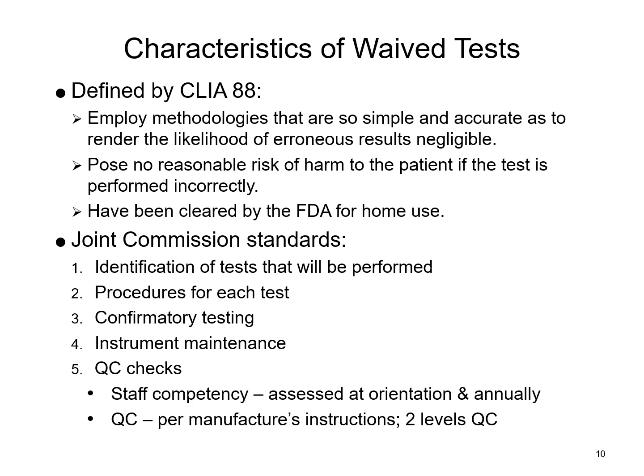So again, waived testing is simple, easy to do testing. It doesn't really pose any risk or harm to a patient if it is performed or interpreted improperly, and it has been cleared by the FDA for home use in most cases. The Joint Commission has standards as far as what should be required for your facility when using waived type testing.